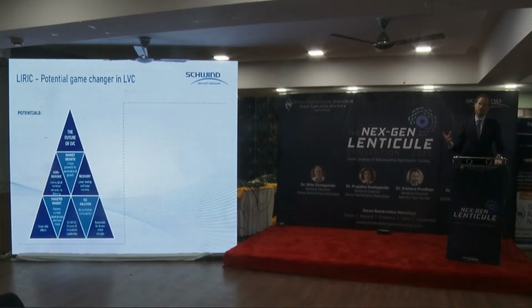The idea is changing the relationship of collagen and water in the cornea with a femtosecond laser, but with femtosecond pulses which are below the gas bubble threshold. So it's similar to creating a diffractive lens in the cornea.